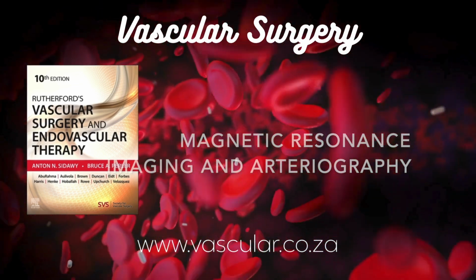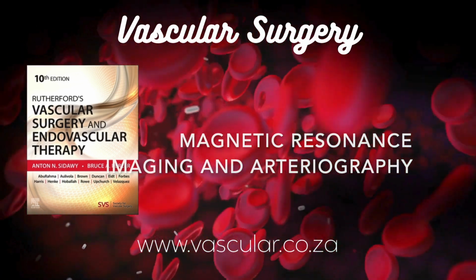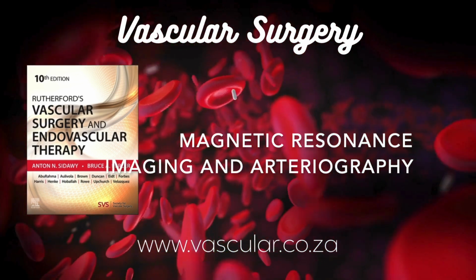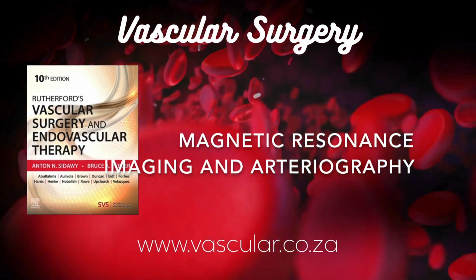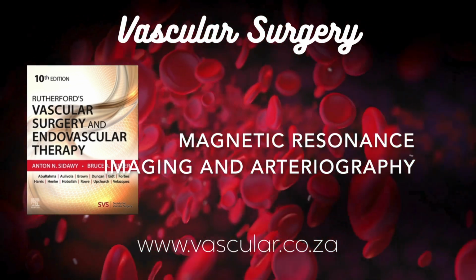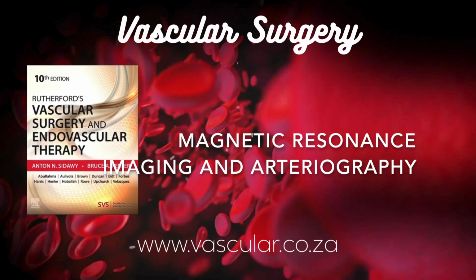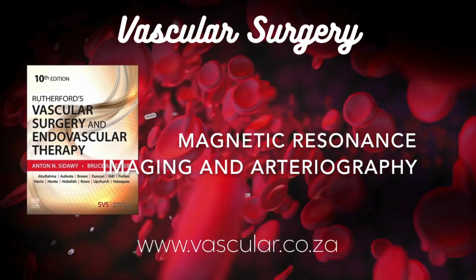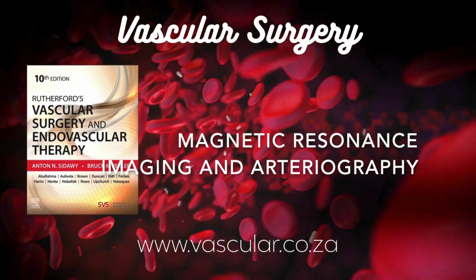Usually we go from top to bottom, proximal to distal, but sometimes if the main problem is suspected lower down, we might do a reverse step table. Any drawbacks to step? Well, it can take a bit longer overall, and sometimes by the time you get to the lower stations, the contrast might have started washing out of the arteries and showing up in the veins, which can make interpretation a bit trickier. That's called venous contamination. Okay.